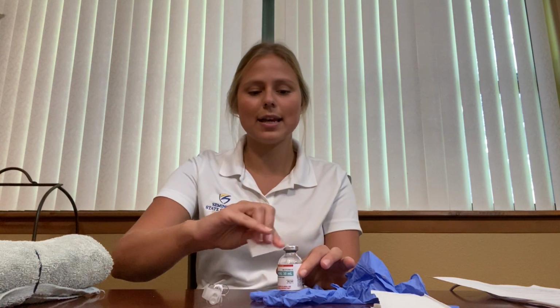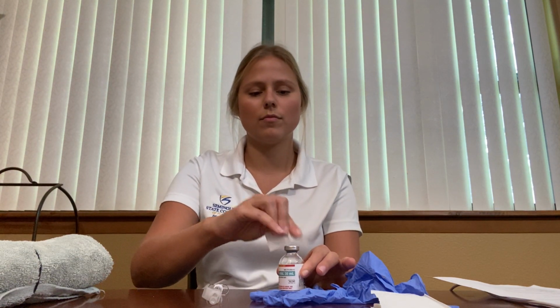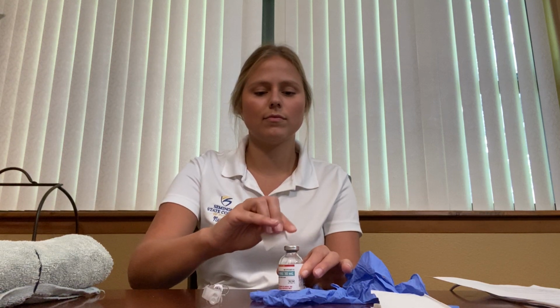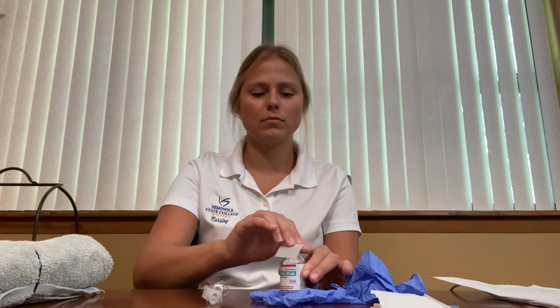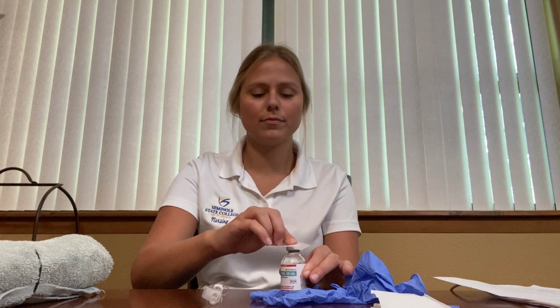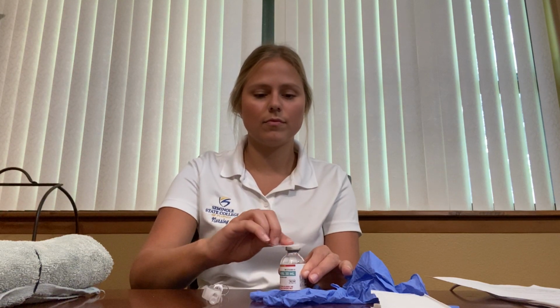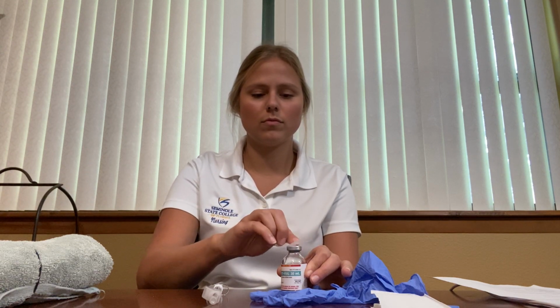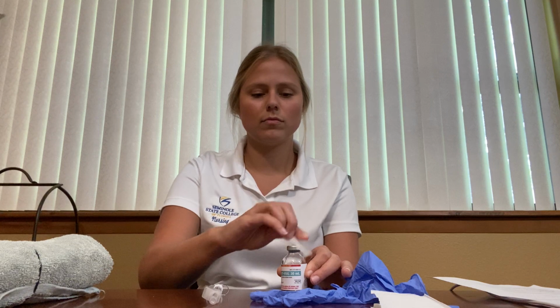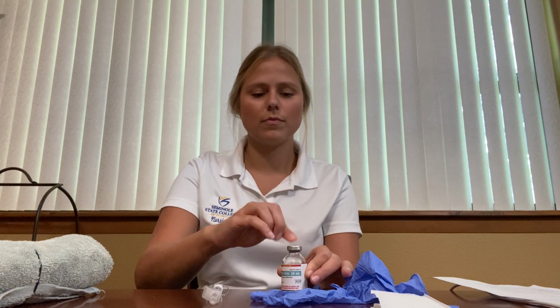Okay, 30 seconds. All right, 30 seconds, kind of let that air dry. I'm not going to fan it with my hands or anything. Then I'm going to safely uncap my needle using the rainbow method.